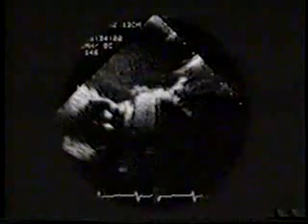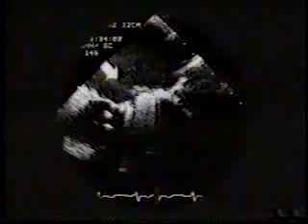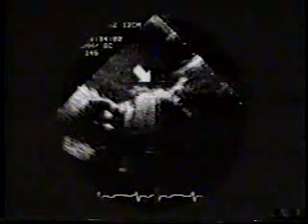This is a systolic frame. The cusps of her native aortic valve are slightly thickened. The mitral ball is seated at the sewing ring, and this is a vegetation. You will appreciate mobility of the vegetation in real time, and you will also see a swirling pattern of flow within the left atrium. This vegetation, attached to the sewing ring, was confirmed at surgery when this prosthesis was replaced.